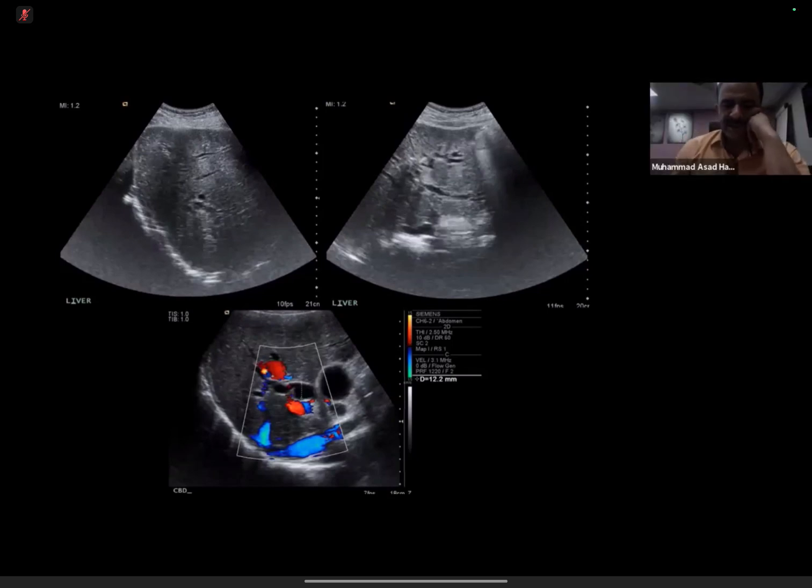Very well described. Basically, one tends to get into one of the dilated ducts, depending upon which one is easily accessible. You can go through the right side or the left side, or if only one side is obstructed, as we may see from time to time, depending upon the obstructive pathology, then you go for the same side.